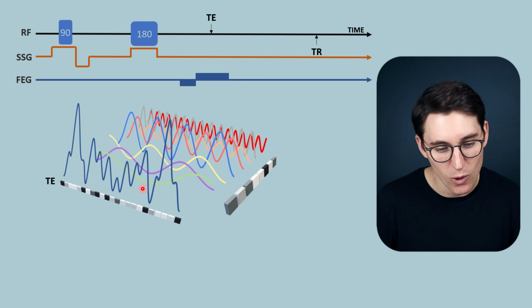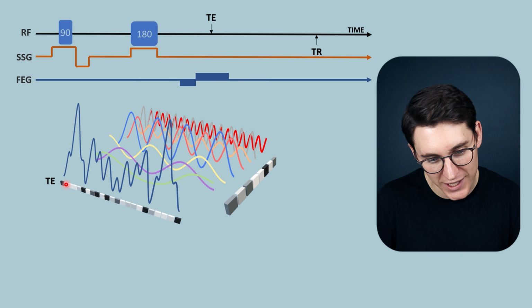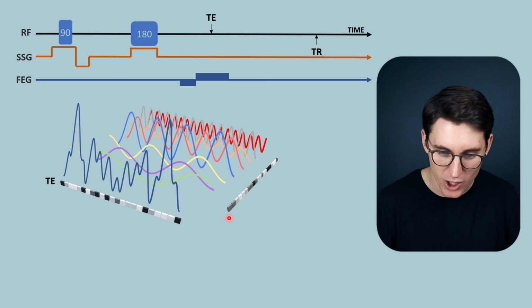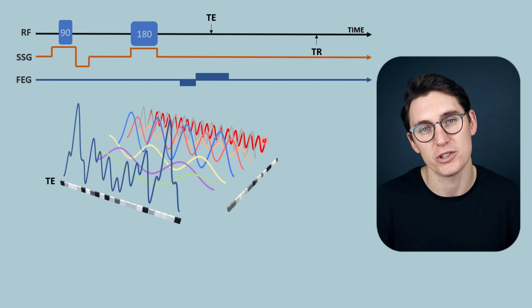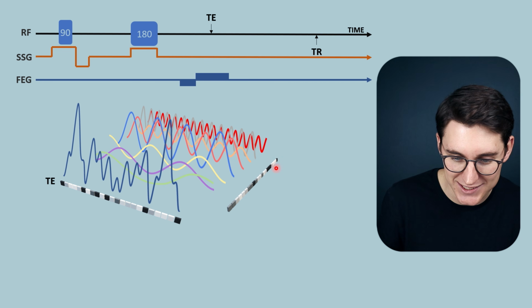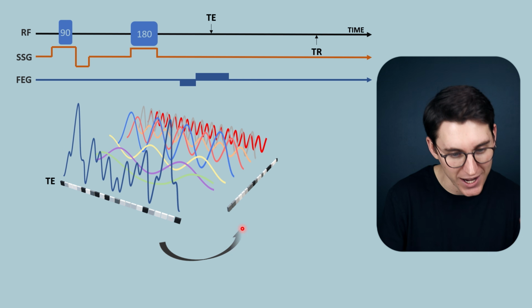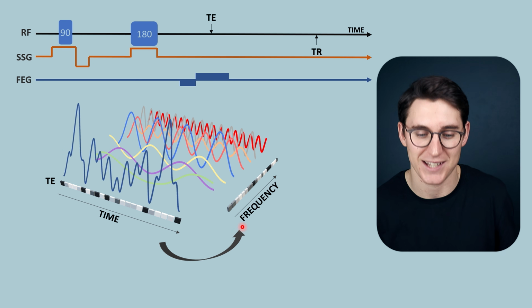My example here is what's called oversampling, where we've created more data than we need if we're only looking for 8 points here. In fact, this data here will give us an image that looks like this. We've delineated into many more frequencies. I just haven't been able to draw all of those frequencies here. And what we've done is converted this time-based data set into a data set that changes over frequency. And we know that frequency is a proxy for x-axis location. We've taken a time-based data set and changed it into a frequency or location-based data set.